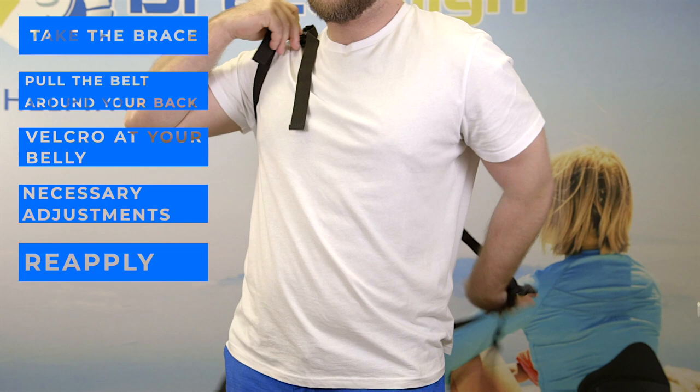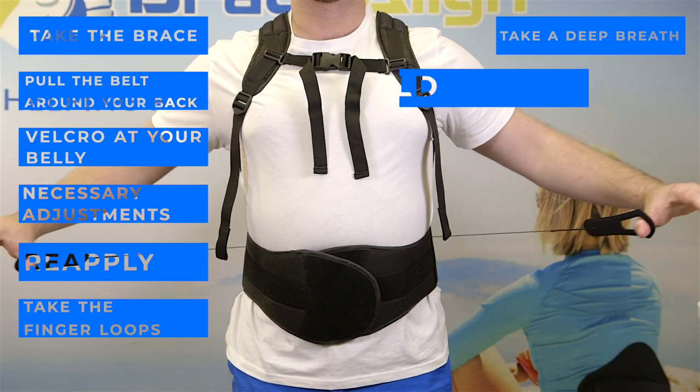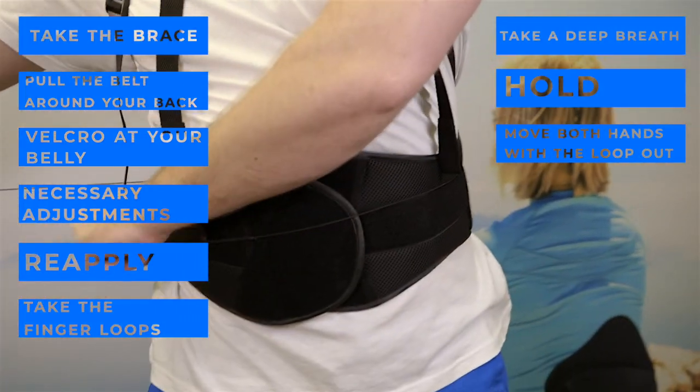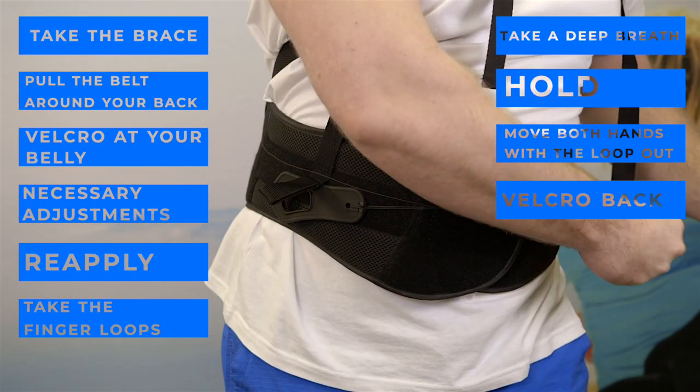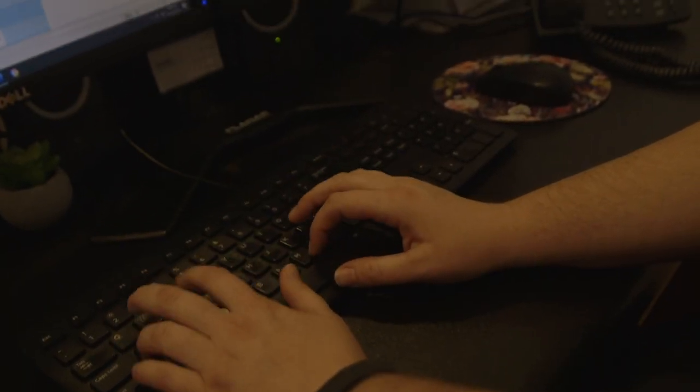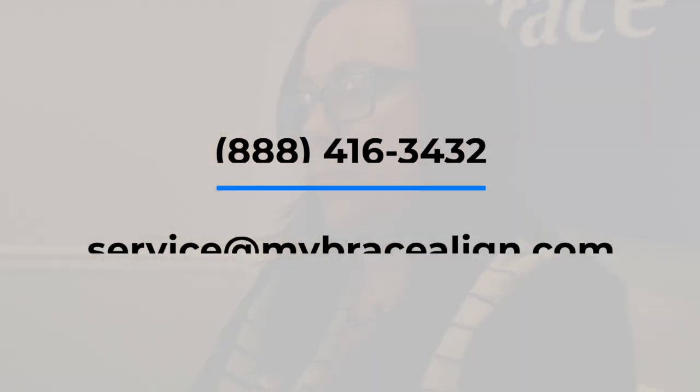Once you have the correct fit, take the finger loops in each hand, take a deep breath, hold, and move both hands with the loop out to the side of your body and velcro back onto the belt. You are ready to use the brace. Thank you again for choosing Brace Align's back brace. If you have any questions, please call or email us.